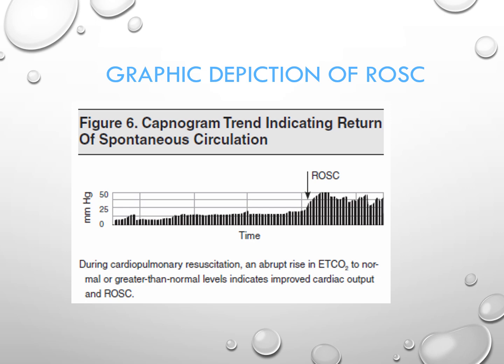And what you will see, looking at the various values, is you're really aiming for a capnographic number of about 15 or higher. And you see that in about the first 2/3, working from left to right. After about 30 seconds of CPR, you see the waveform capnograph a little bit north of, it's probably around 18, approaching perhaps around 20.